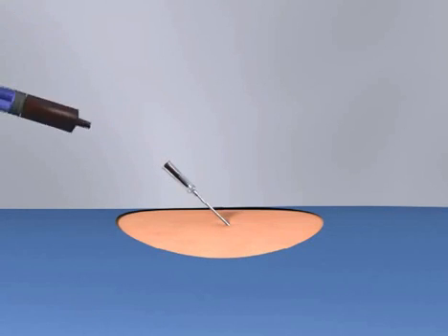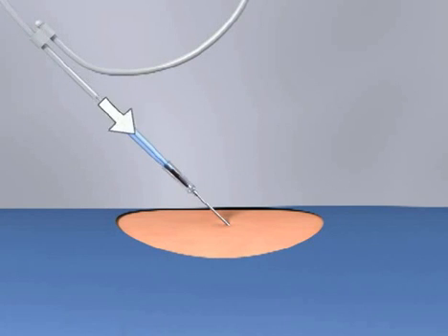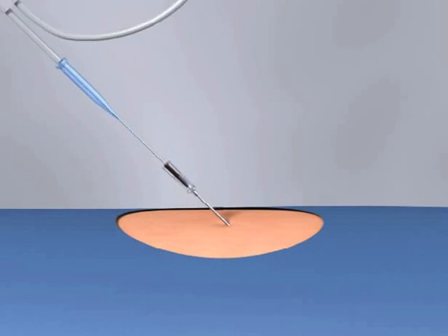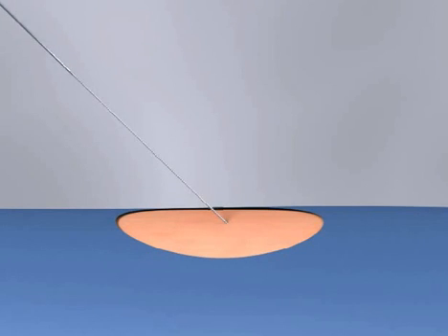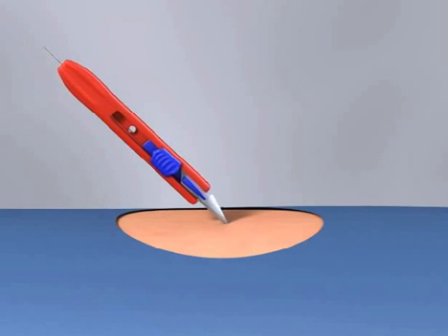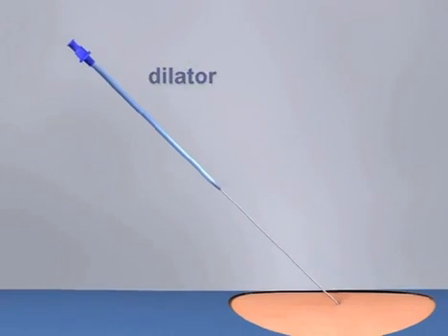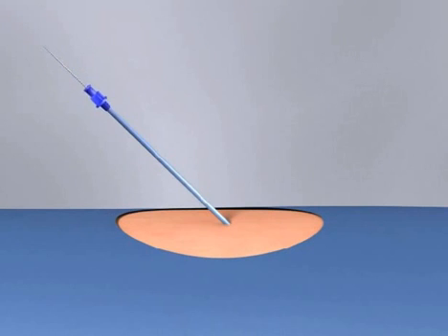Carefully remove the syringe from the needle. Insert the guide wire assembly into the hub and advance the guide wire into the vessel. Once approximately 15 cm of wire have been advanced into the patient, remove the plastic housing, leaving the guide wire in place. You may now remove the needle so that just the guide wire remains in the vessel. Use the 11-blade scalpel to create a small nick in the skin around the guide wire to facilitate passage of the dilator and the catheter. Carefully advance the dilator over the wire and into the subcutaneous tissues with a slight rotating motion and then remove it.